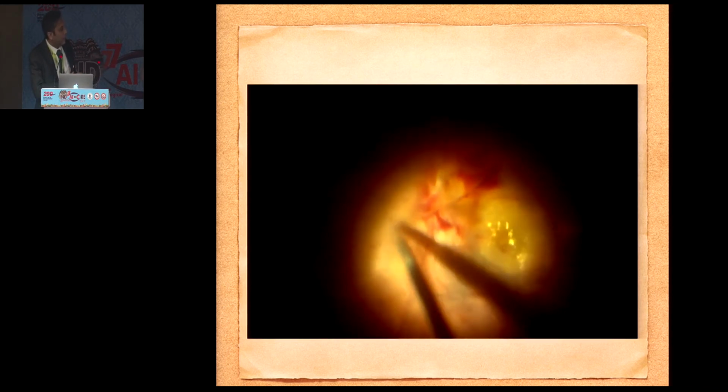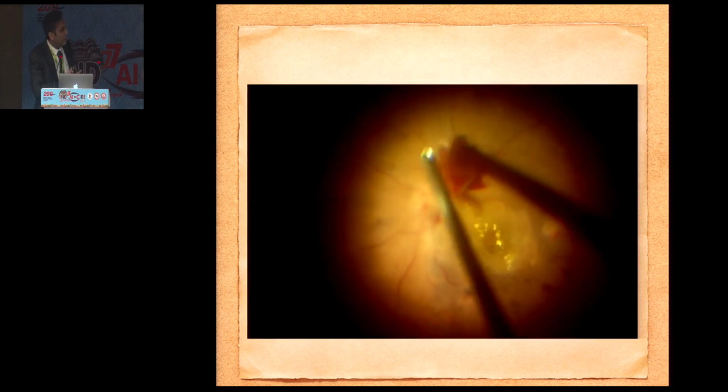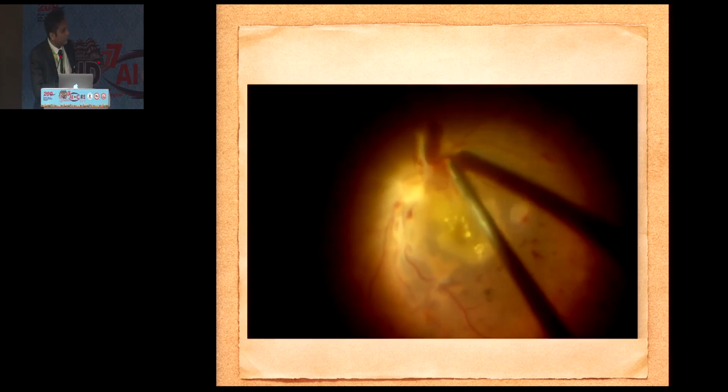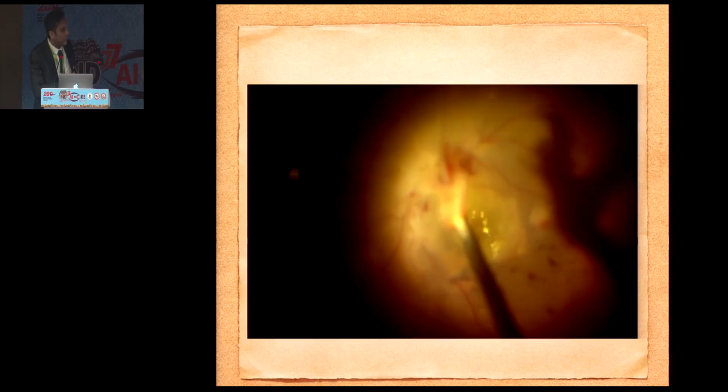So there was a fibrovascular proliferation of the disc. After ILM peeling, we had to remove it. So we did an outside-inside technique, and there was a cleavage plane nasal to the disc. And going with that, we went towards the disc, and it came off in toto. Leaving that would have again caused recurrent bleeds, even though there was no traction on the macula.